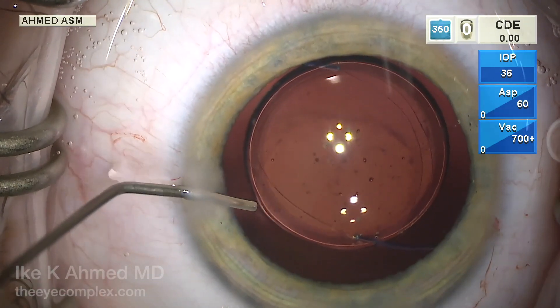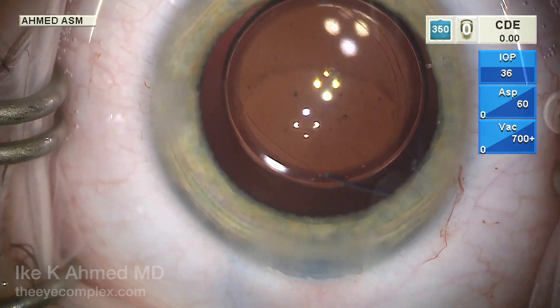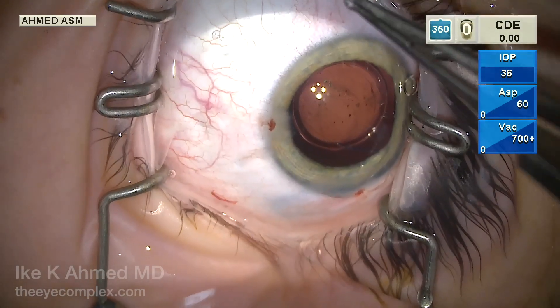We're now removing the viscoelastic manually through the main incision. These are very elastic eyes — they can collapse, so do it slowly. I don't go back with the IA here. We have a watertight incision, and we'll inject some Kenalog subtenons for early postoperative inflammatory control.